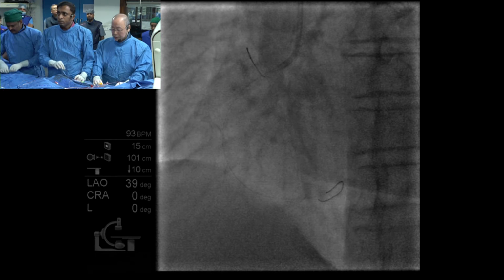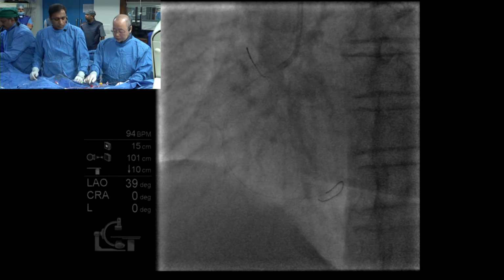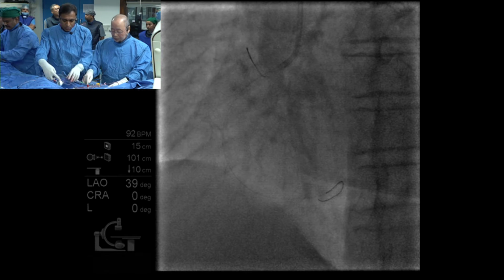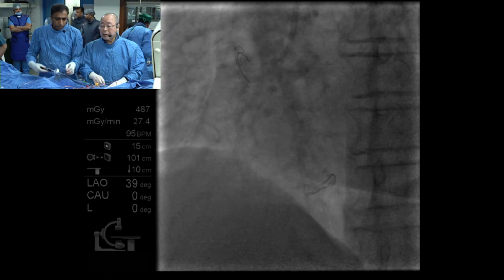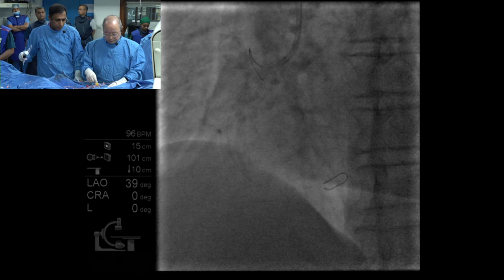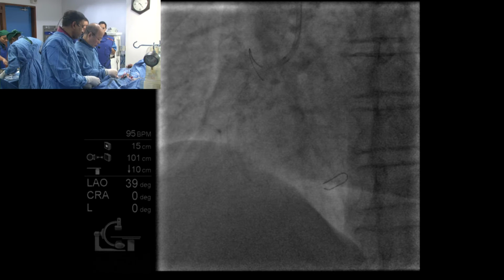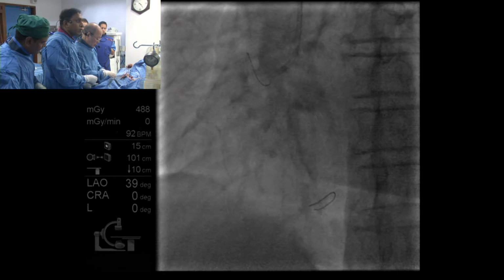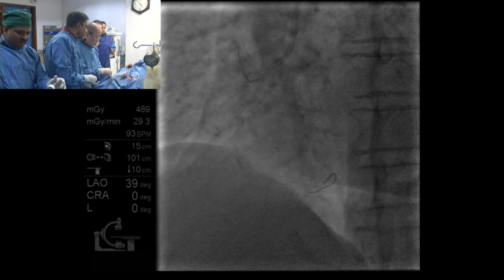Okay, so take this balloon out, and I want to dilate by using this balloon, okay? Comments from the panel on your antegrade microcatheter? I mean, there's no perfect microcatheter. Do you have any particular comments to make? So Dr. Saito, you take the anchor balloon out.